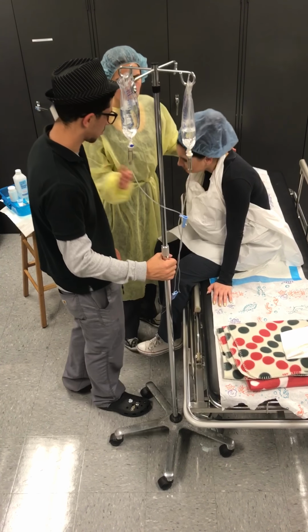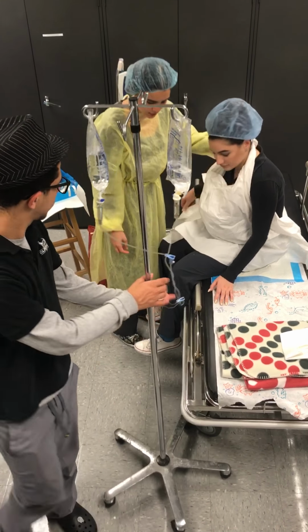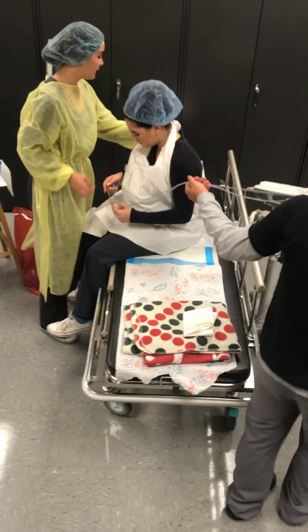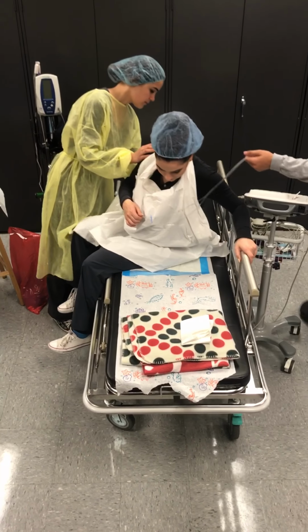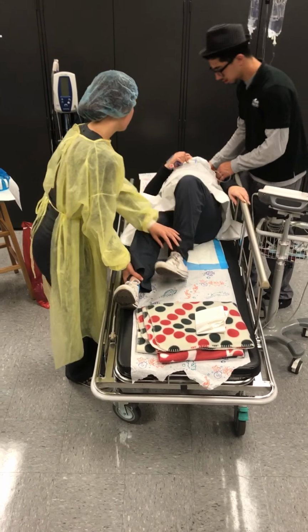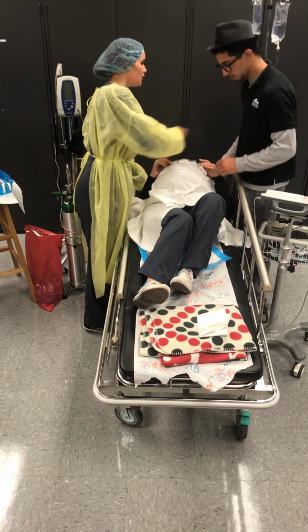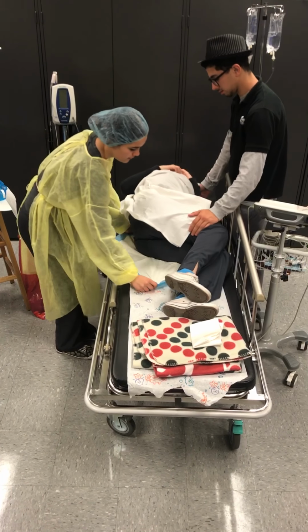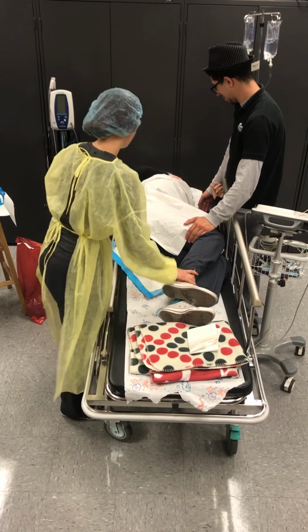All right. Daddy, if you could just go to the other side for me, please. Okay. Thank you. Okay, now we're just going to lay back, okay? And now turn yourself facing the father, and get your back towards me. Perfect. There we go.